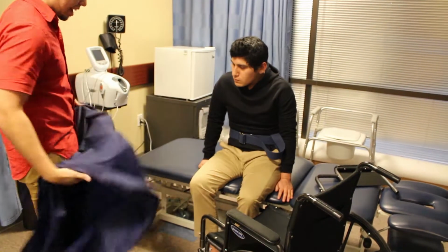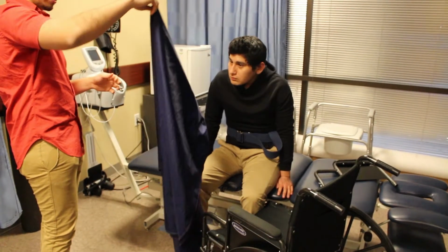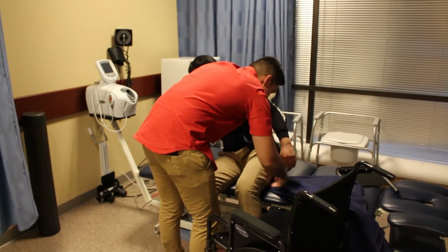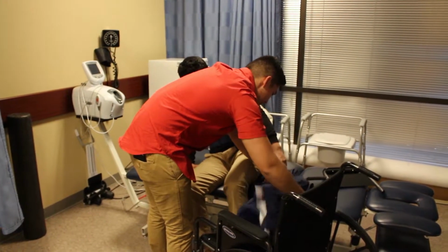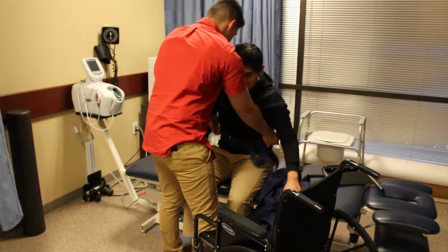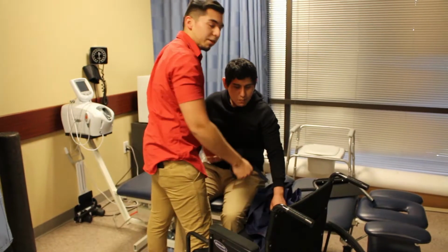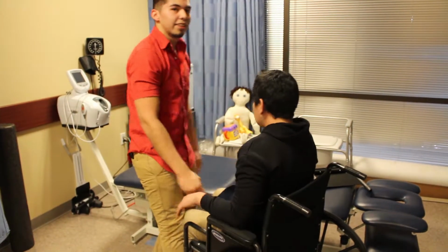So you want to fold the sheet in half again. You want to grab it from the middle and stick it under the bottom, just like that. Sort of like a sliding board. There'd be no need for you to actually lift them. It's more of a sliding motion. So you just slide them, and it slides straight onto the wheelchair.